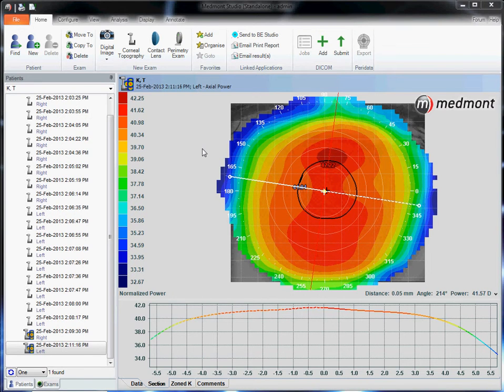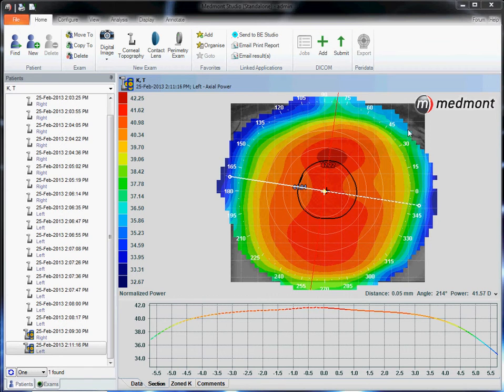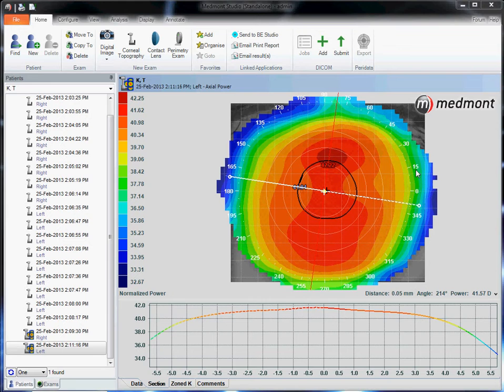This video describes the contact lens module available in the Medmont E300 corneal topographer. Start by selecting the best map to construct your lens from. Ideally use the composite map feature so you're able to image 100% of the visible iris, which gives us a large analysis area to construct the lens from.